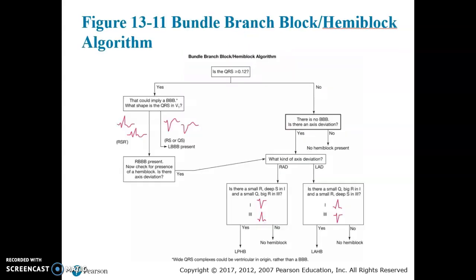And then there's a nice algorithm here that you can use to help you determine what type of block this patient has. I'm not going to sit here and go over these next strips with you on the video. I want you to take a peek at them and work through the algorithm. And if you find questions, please let me know. But as you're working these next strips, 1 through 10, the answers are in the back of your book. So you can definitely look and compare to see if you're correct or not. But please, if you have questions, let me know.